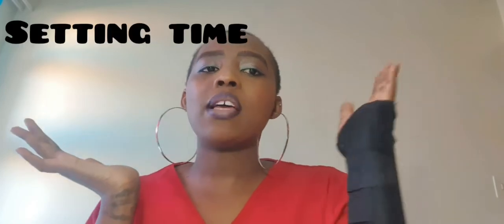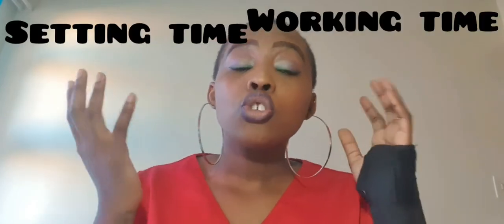And then from there, alginate has setting time. Okay, your slide, as I see it, talks about setting time. So I'm just gonna break it down in terms of setting time as well as working time. So you need to be able to distinguish between the two. So your slide talks about setting time.